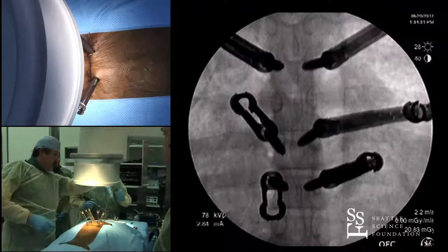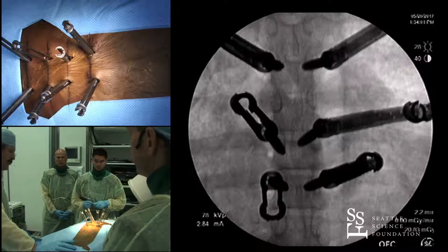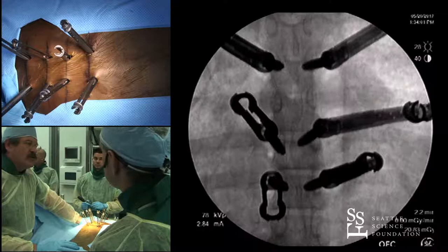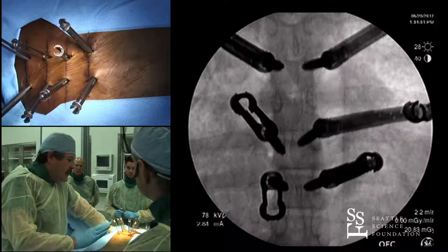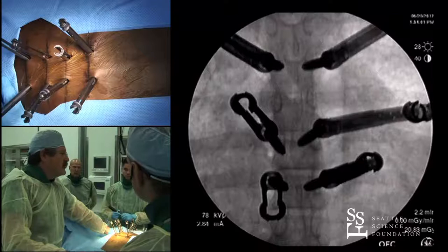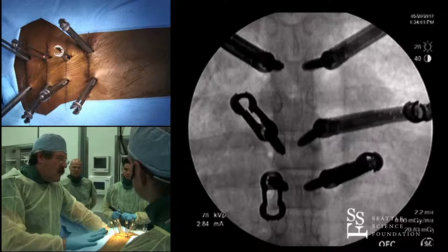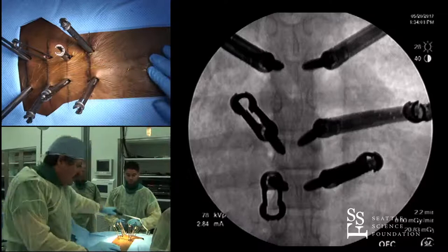Regarding neuromonitoring — I use SSEP and motor monitoring for all of these cases. As for stimulating the screws, I don't do it. The problem with screw stimulation is it's very sensitive. I had a partner who always did it and was always taking out screws; every time you run a screw in and out of a pedicle you lose some strength to that construct. He was always saying screws stimmed wrong, but I've never left any out and I don't have those problems. I think it's overly sensitive, causes unnecessary intervention, and weakens constructs. It can be a useful tool, but that's why I don't do it.